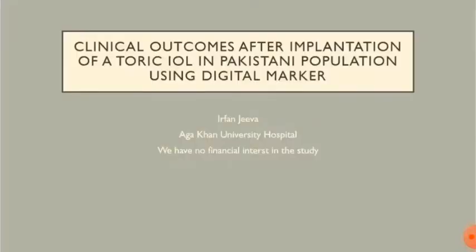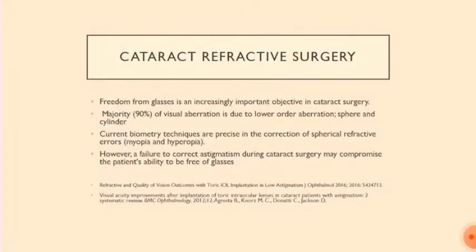Right, thank you very much. Organizers, chair, moderators, thank you for inviting me to give a talk. My talk is on how to manage astigmatism when we are doing cataract surgery. This talk will be divided into what the world literature is saying and a study that we've just submitted.